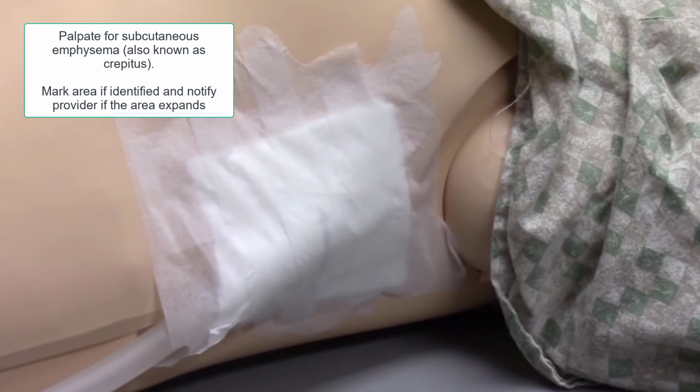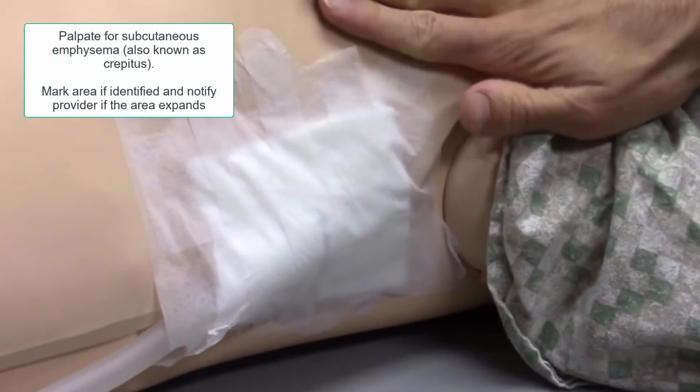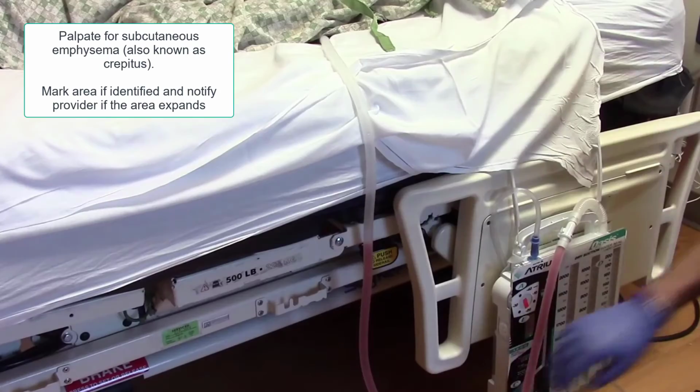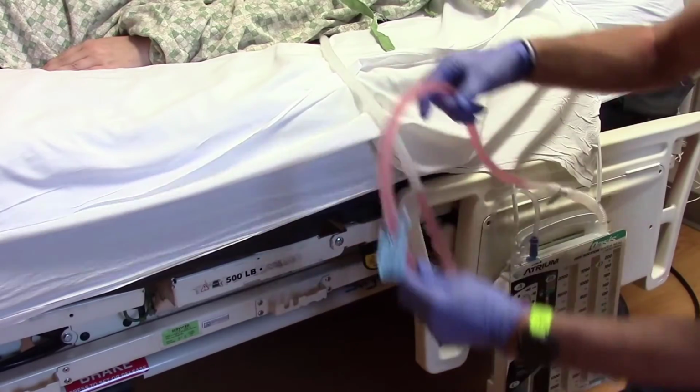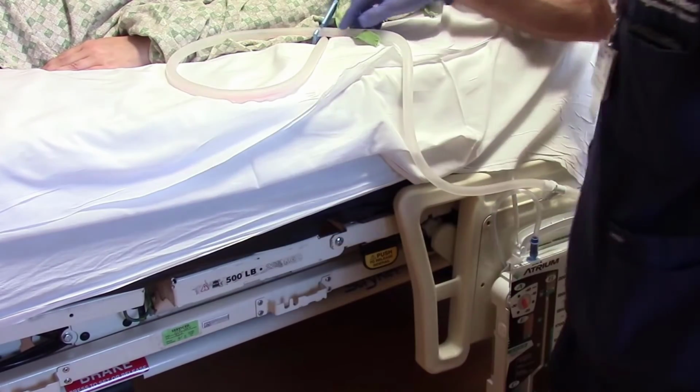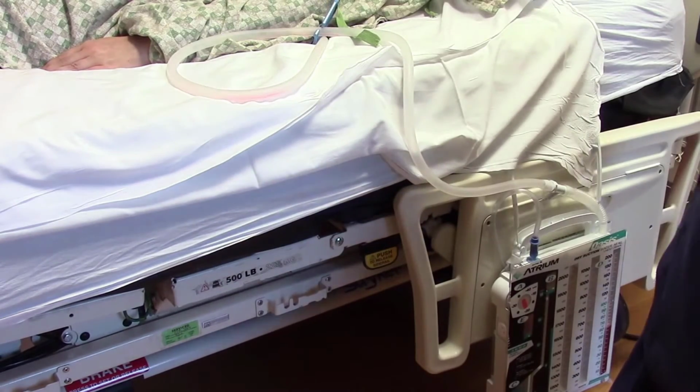Assess the dressing to make sure it is dry and occlusive. Inspect the skin for signs and symptoms of infection and palpate the surrounding skin to identify subcutaneous emphysema. Remove any dependent loops from the tubing by looping it on the bed or chair. This allows gravity drainage and prevents pressure from building up in the pleural space.